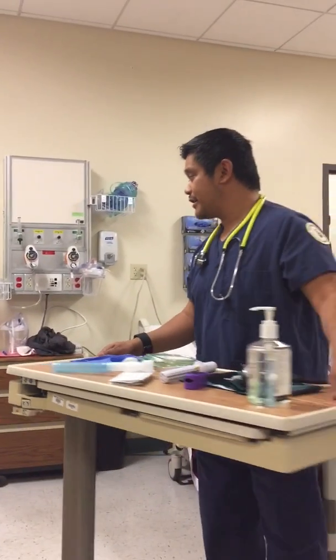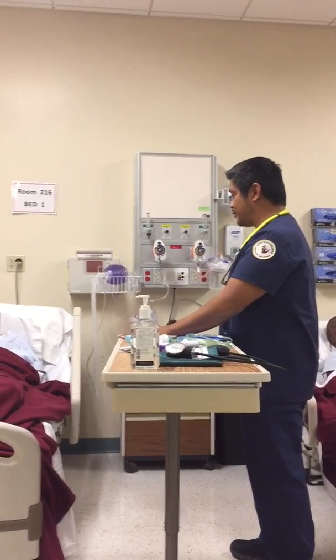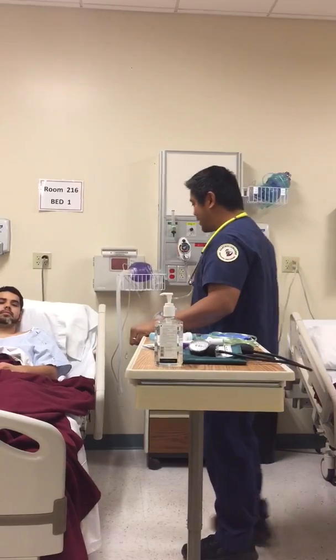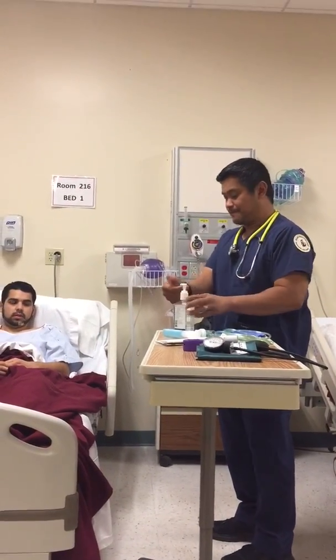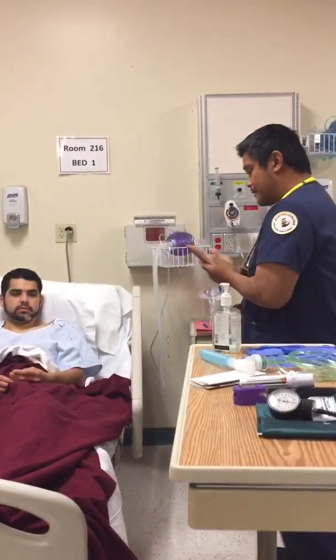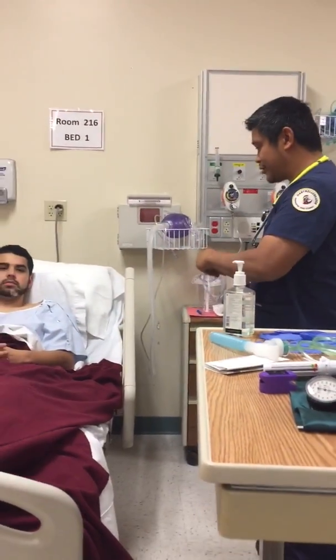Hi, my name is Richard. I am a student at Hartnell College Respiratory Care Program. I'm here to do a treatment for you. Hopefully that's okay. And may I have your name and date of birth, please? Christian Gelvin, 5/25/1991. Check on your wristband. All right, thank you, Christian. Is it okay to call you Christian?